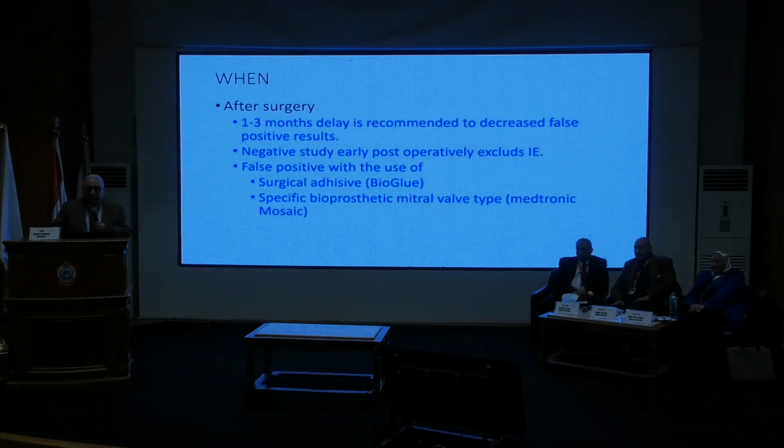Meanwhile, a negative test in the recent post-operative period is a very good negative test. It can almost exclude the presence of infective endocarditis. But it is not a very good positive test, because the closer we are to the time of operation, the more false positive results can occur. Also, some false positive results can occur due to some surgical procedures, some surgical adhesive, and some prosthetic valve types.